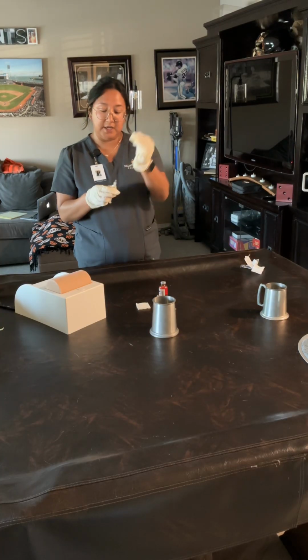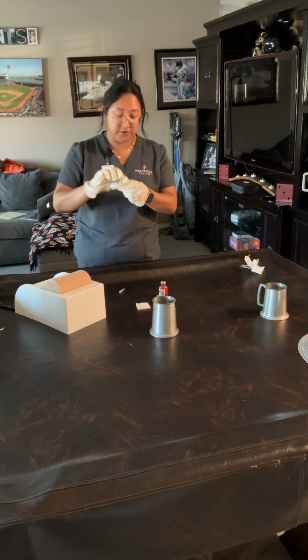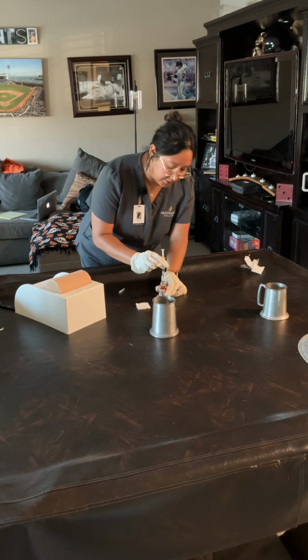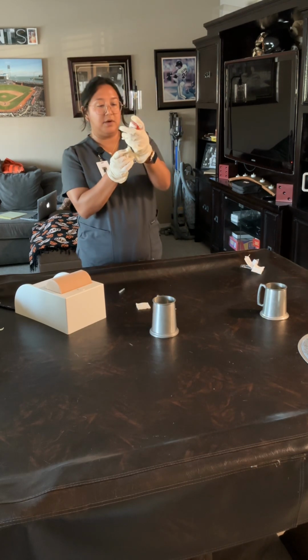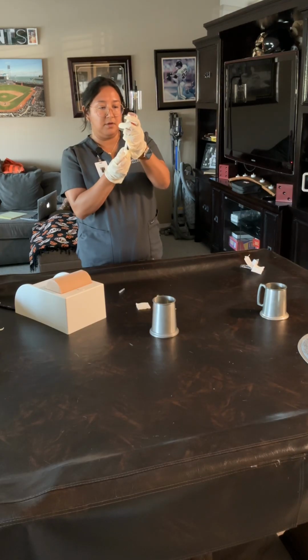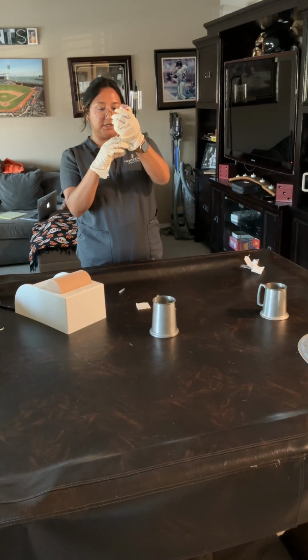Next, I will uncap it. I have 1.5 milliliters here drawn up. Insert the air, and then I'll go ahead and draw up 1.5. And then it's okay to draw up a little bit extra just to get all the air bubbles out. Perfect.